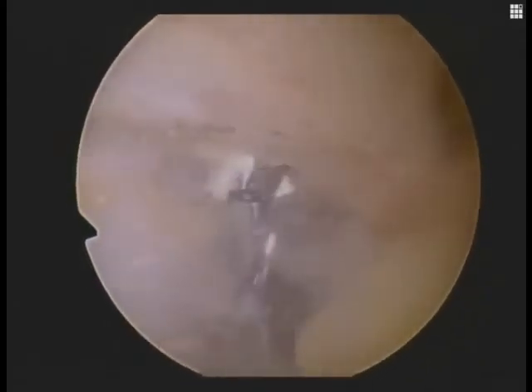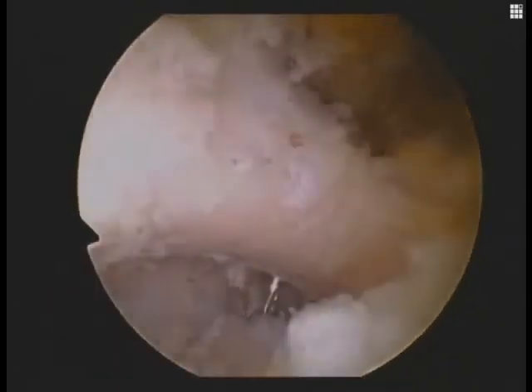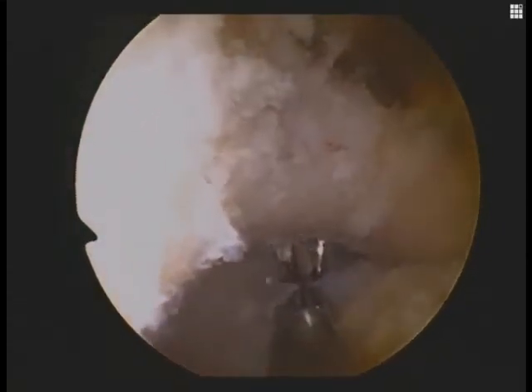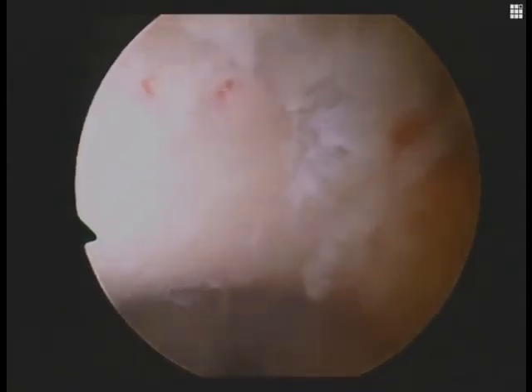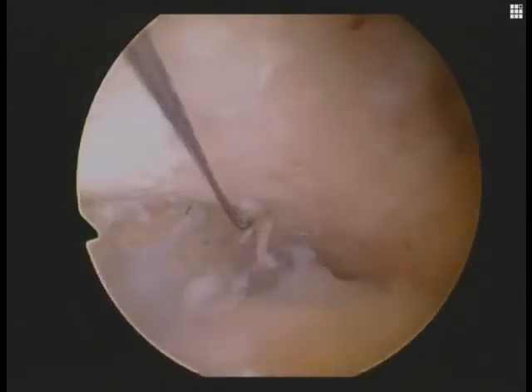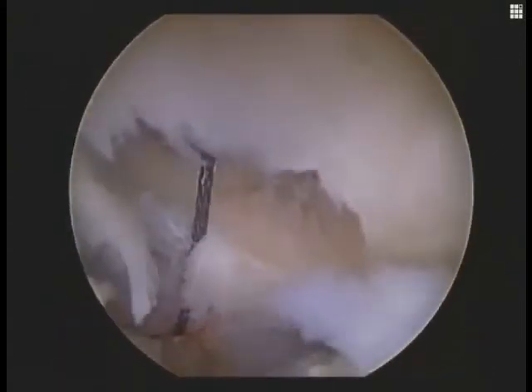We then pass a nitinol passing suture looped wire for eventual passage of our GraftRope construct. The lead suture is a striped tiger wire suture, seen here as it's passed via the nitinol wire as we visualize the inferior circumferential margins of our coracoid drill hole.